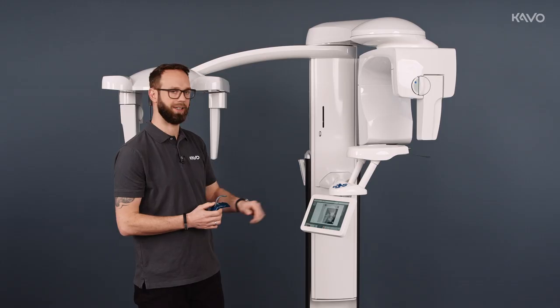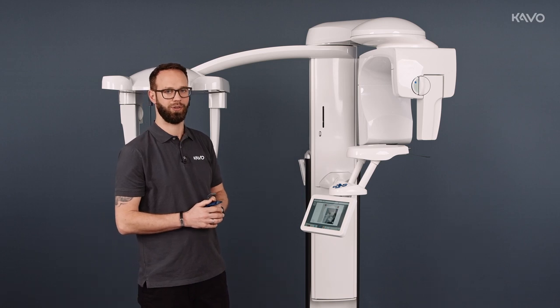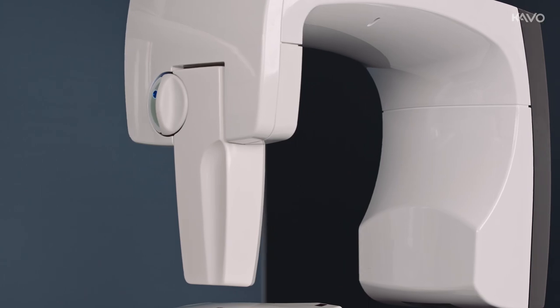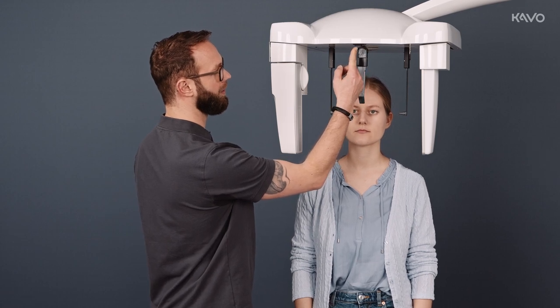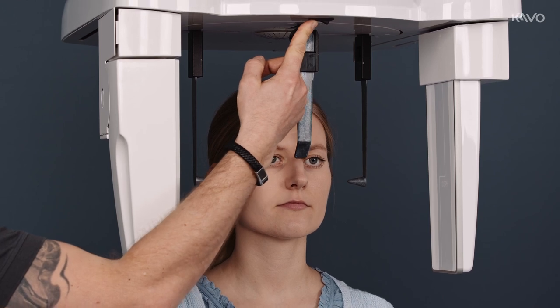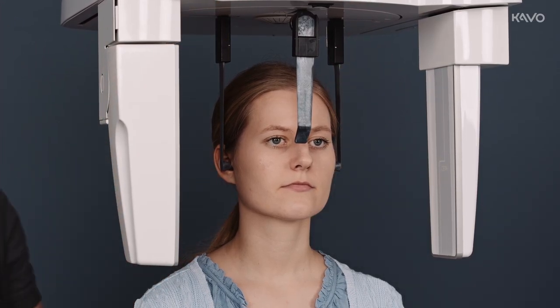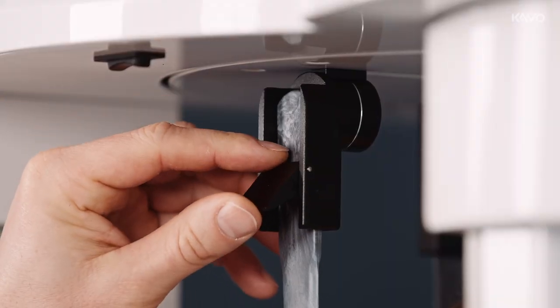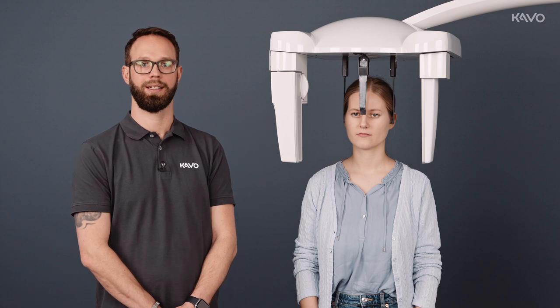Again, we have the patient pre-selection display. We can switch to the positioning level and call our patient into the X-ray room and position them in the unit. We use the toggle switch to move the equipment up and down to adjust the eartips to the correct height, pressing the silver toggle switch and inserting them into the ear canal. Now we set the Frankfurt horizontal and position the nasion at the bridge of the nose. Once we position the patient, we go to the image ready mode setting on the display.